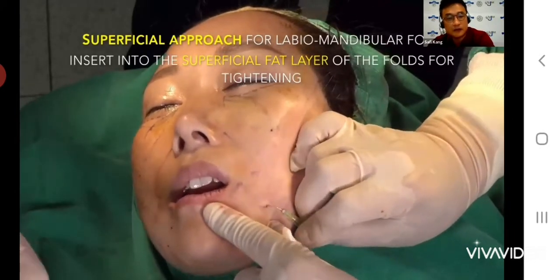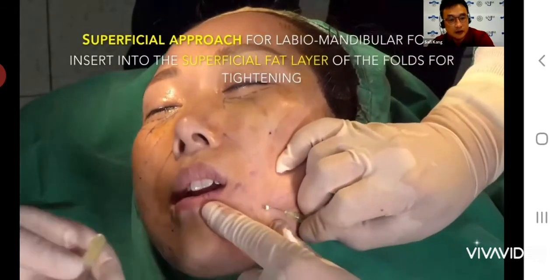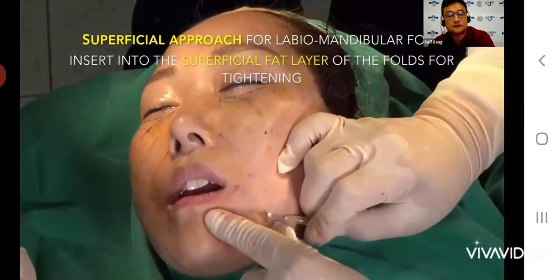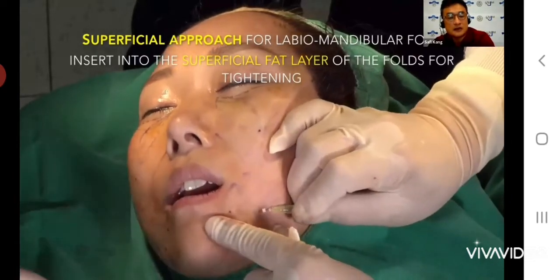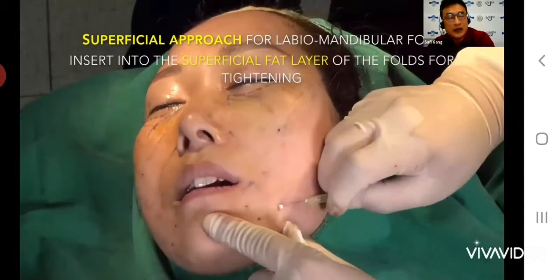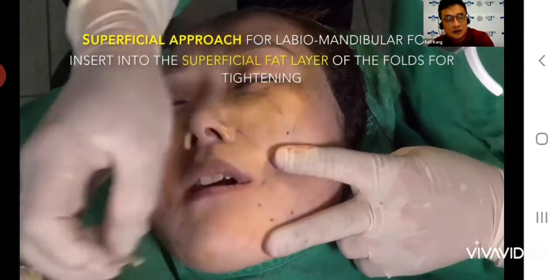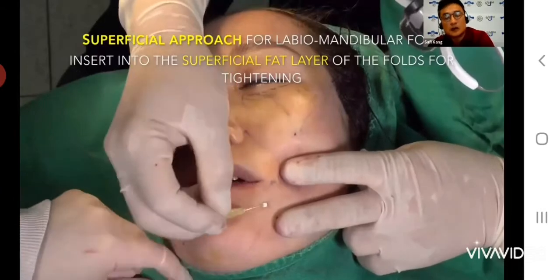And I use the fine thread like this for subdermal insertion. You can see the subdermal thread insertion now. Here you can touch your finger at the skin, and you can see the differences in thickness. So not only in the deep space, but even in the skin, you can recognize the very thin skin. So just lifting is not the only solution.